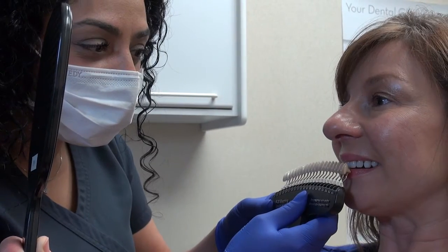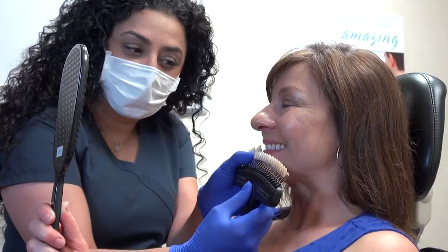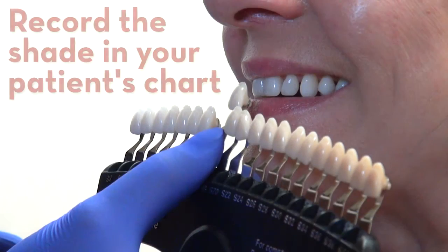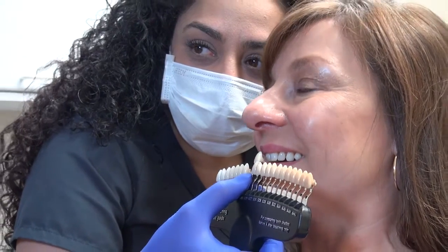Take a bleaching shade guide reading using a front tooth or incisor and share your assessment with the patient, having them agree with the shade by viewing in a handheld mirror. Record the patient's pre-boost shade. For additional instructions, please view our step-by-step video on taking bleaching shade guide readings.